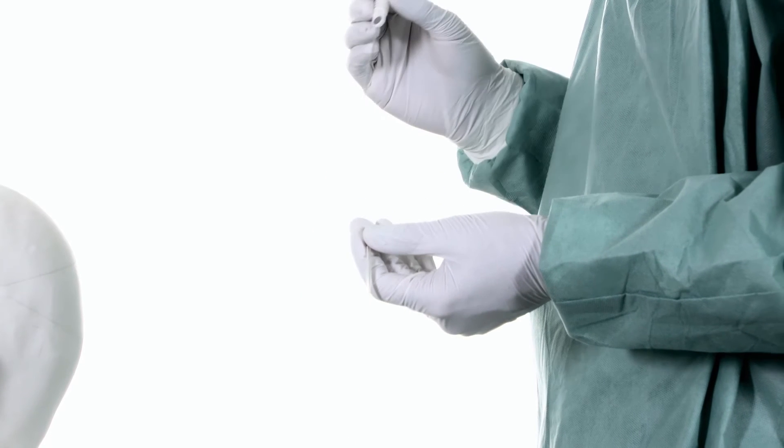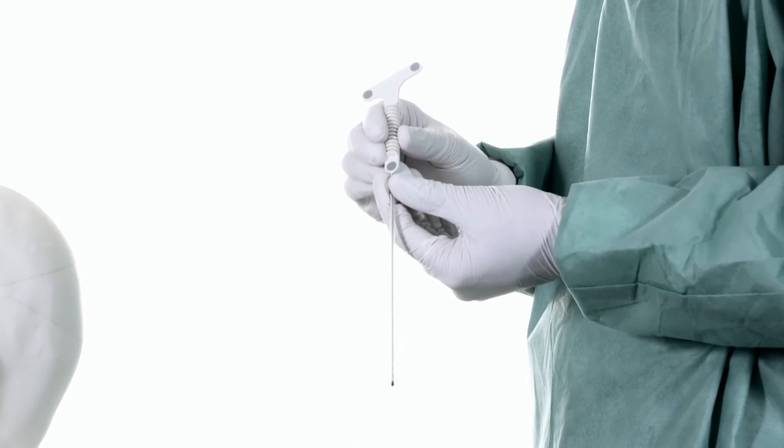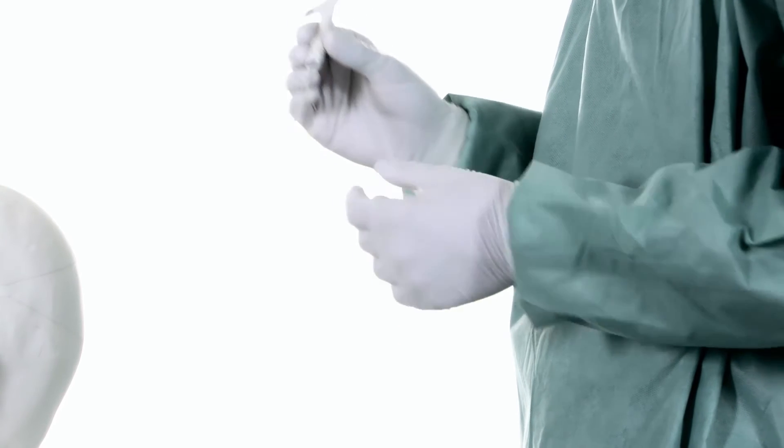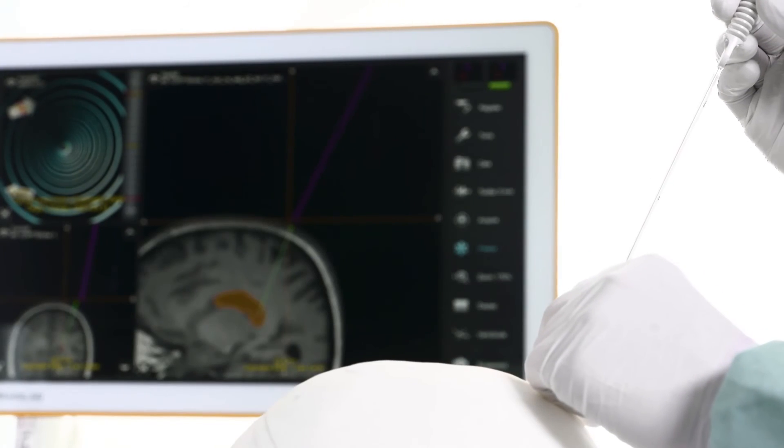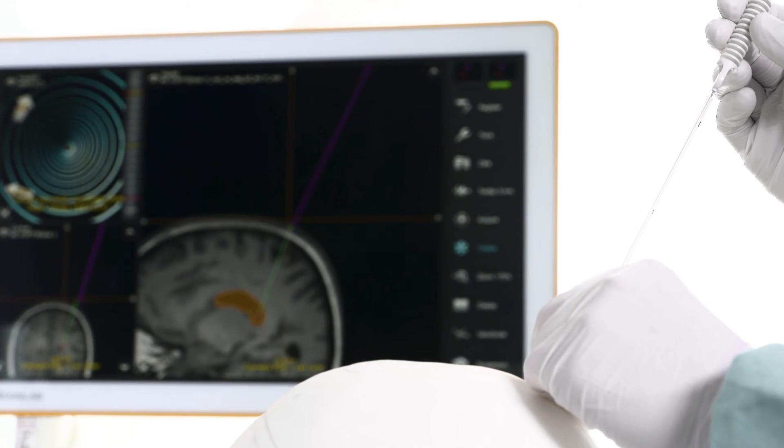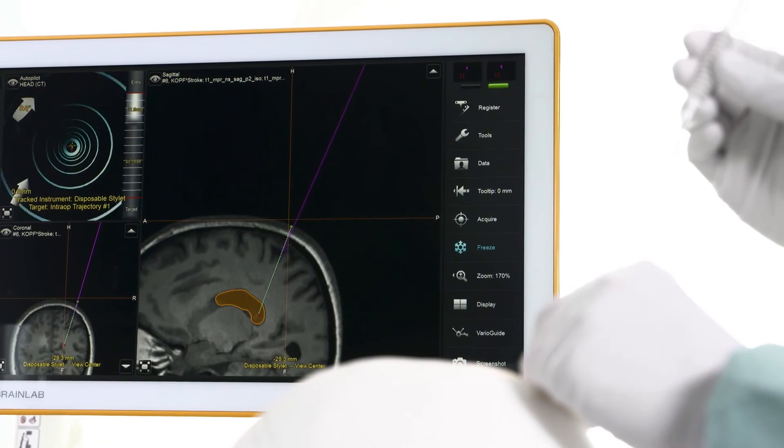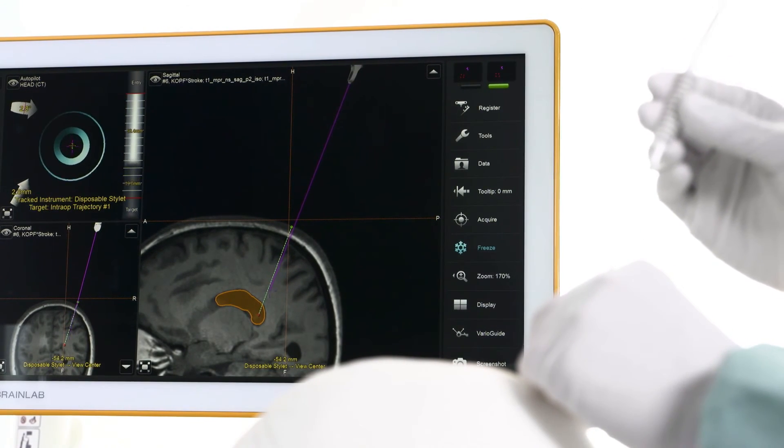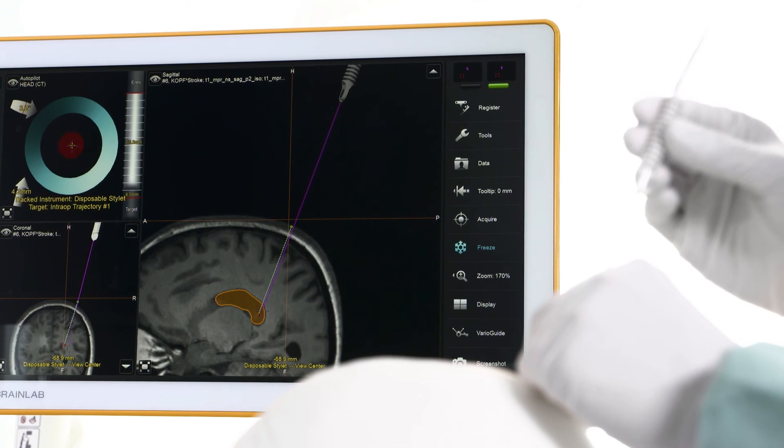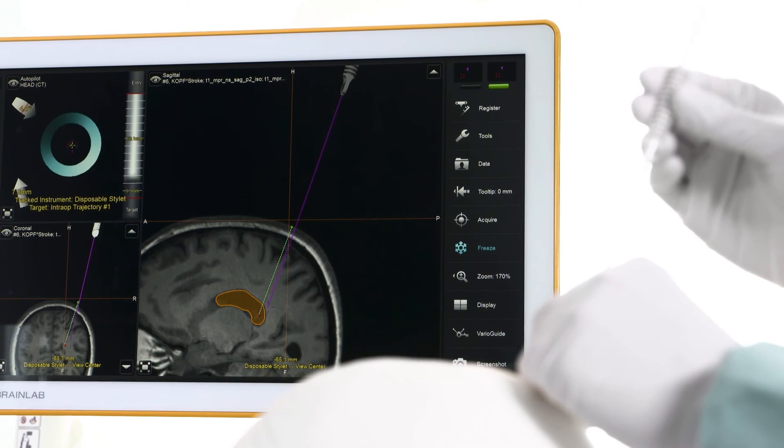Flexible compatibility allows for use of third-party, non-BrainLab shunts and ventricular catheters. After inserting the disposable stylet into the catheter, surgeons can direct both devices to the targeted ventricle along the planned trajectory according to the stylet position displayed on the navigation screen.